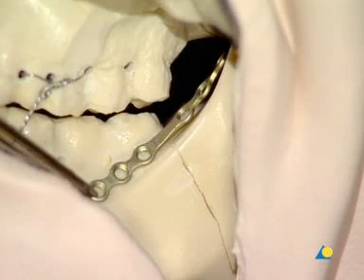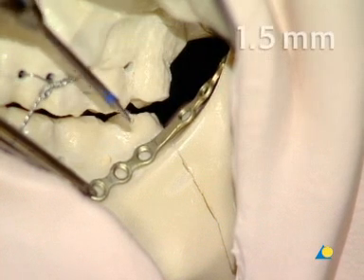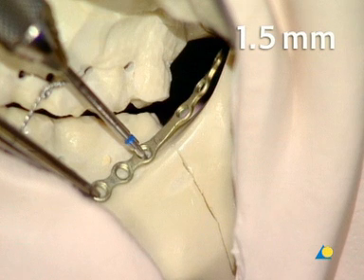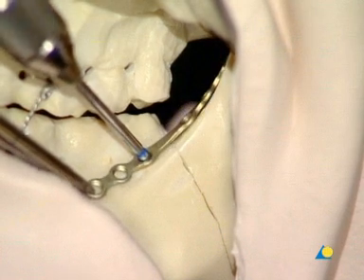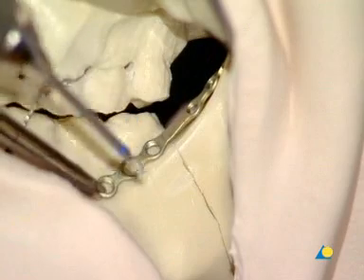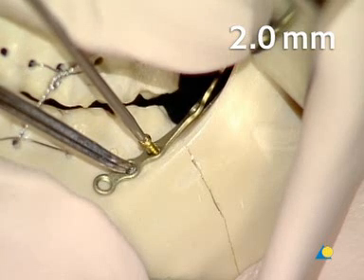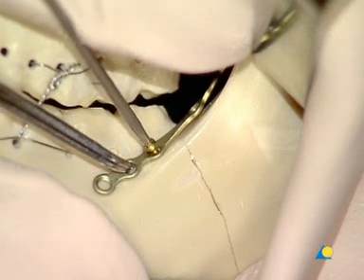The first hole is drilled monocortically, close to the fracture, using the 1.5 mm drill bit with 6 mm stop. The drill must be held at 90 degrees to the bone for the threaded head of the locking screw to engage in the plate correctly. A 6 mm long, 2 mm screw is inserted but not fully tightened, to allow for any plate adjustment.